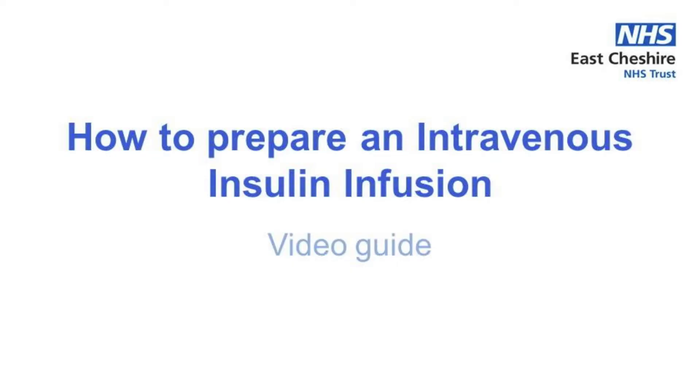This is a video demonstration of how to prepare an intravenous insulin infusion. These steps should be used for preparing both fixed and variable rate insulin infusions for diabetic patients.